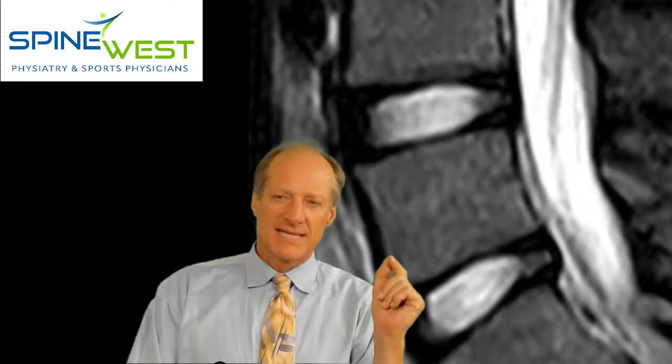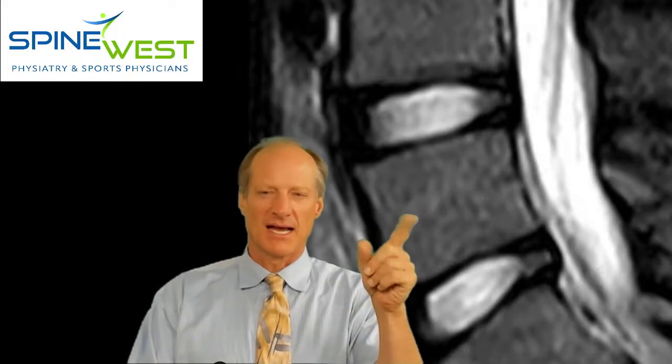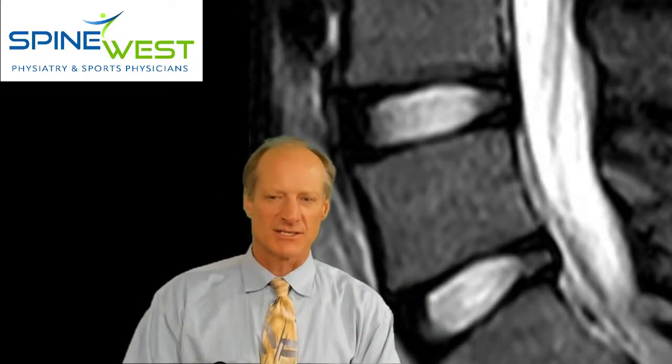The DEXA scan is used for osteoporosis, and that is really an X-ray beam that they shoot through the bones, the femoral neck, the spine, the wrist bones, and how much radiation is absorbed by those bones will determine how dense the bone tissue is.